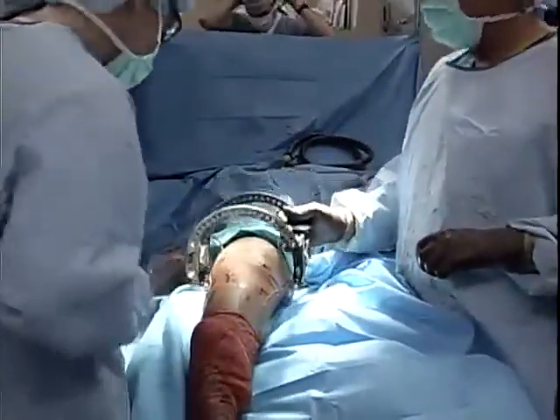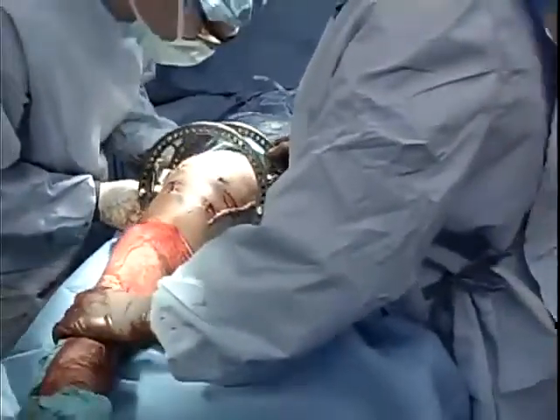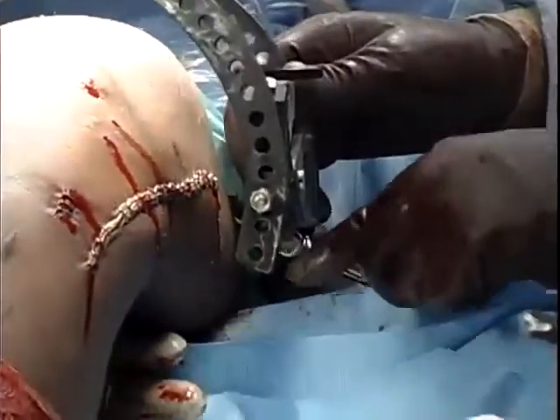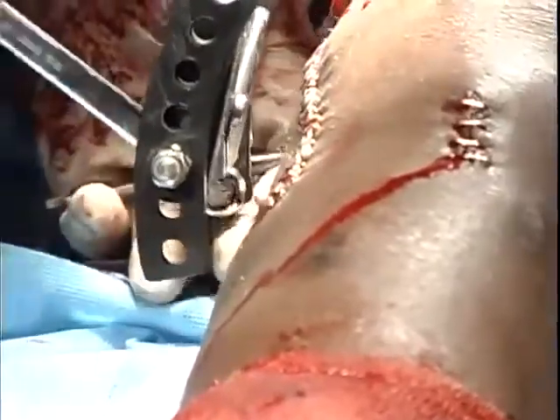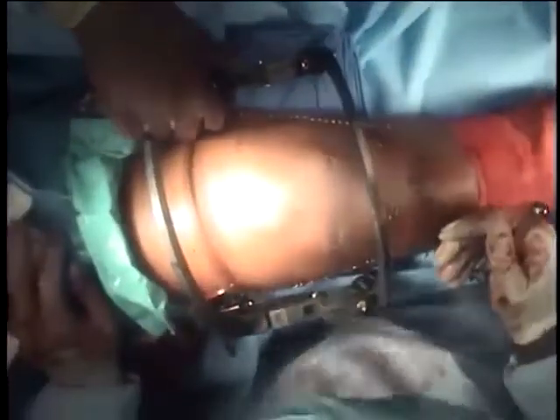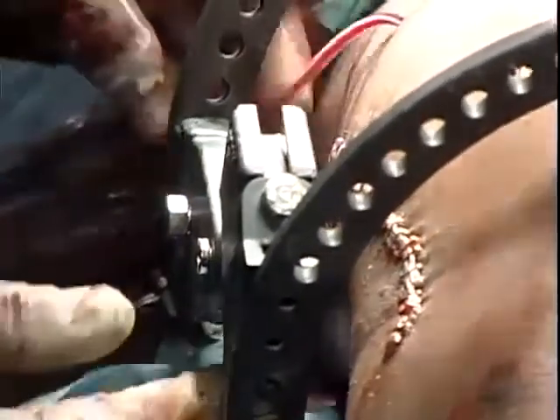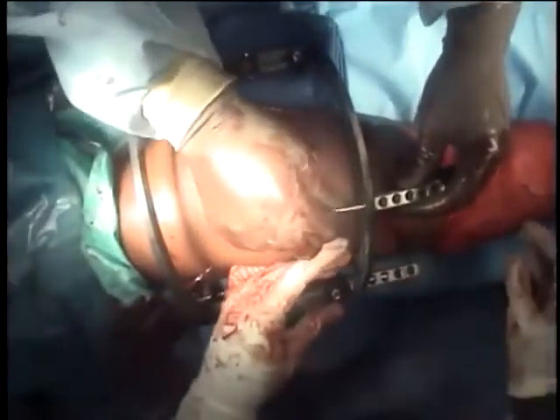At the end of the case, bring the compass hinge back. The two femoral pins and Rancho cubes have been left in place; the skin from both corner reconstructions is now stapled shut. Reattach the hinge through the same posterior holes on both sides to the Rancho cubes, returning the hinge to the center of rotation. Check alignment — if the knee is in a little more valgus than the hinge, loosen the set screw on the bottom, use a wrench to turn the adjustment nut, and tighten back down.